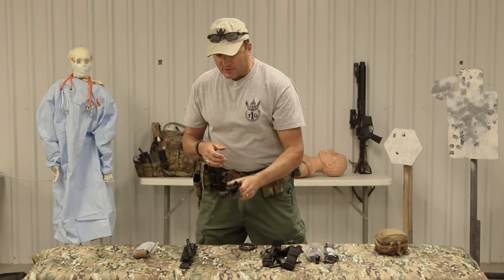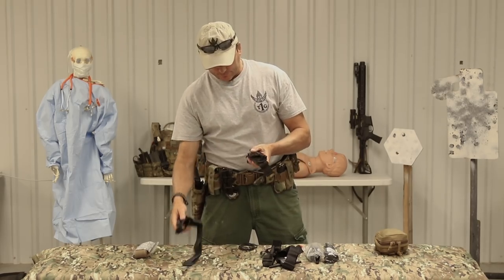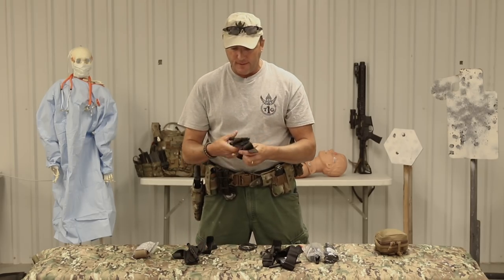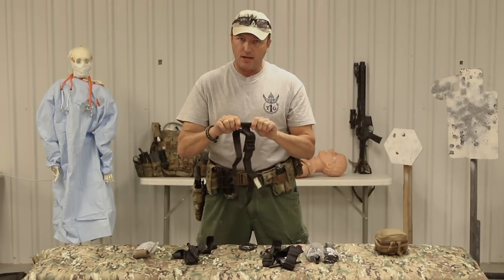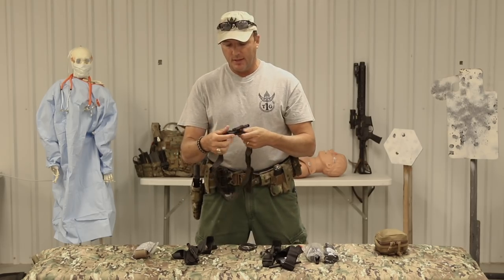That brings us to the SOF-T tourniquet. If you have to treat somebody else, my opinion is I prefer the new SOF-T Wide. Looking at the old SOF-T: it doesn't have Velcro, and the windlass is milled aluminum - this puppy is not going to break, which is a big advantage over the CAT tourniquet.